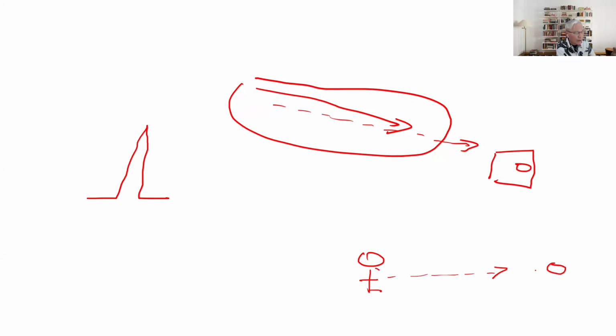This is your camera. The image that will result from the movement of your friend coming towards the camera will be that you will become bigger. Your face will become humongous. It would be big, right? So it's basically the same thing in an electrocardiogram.